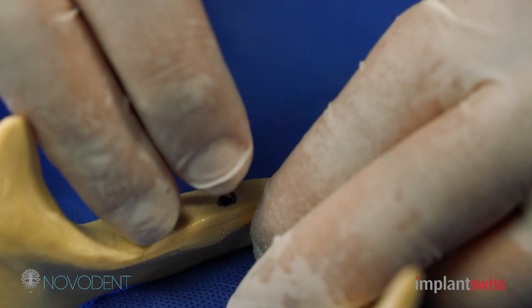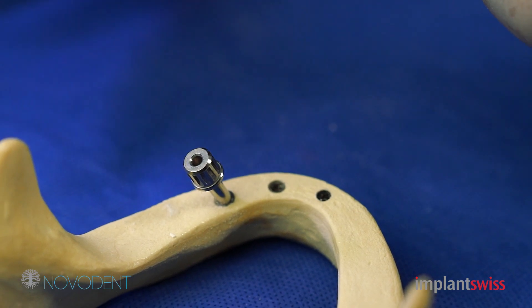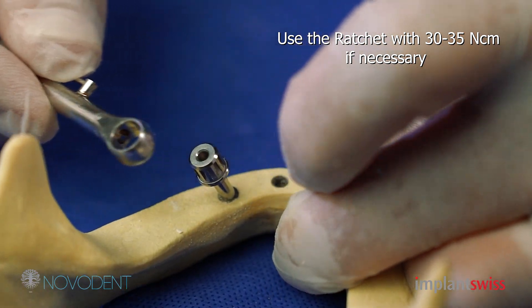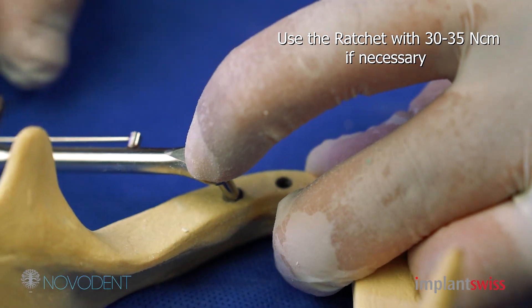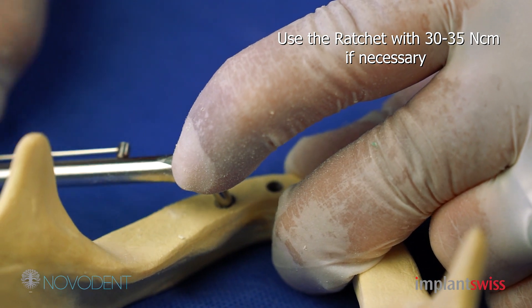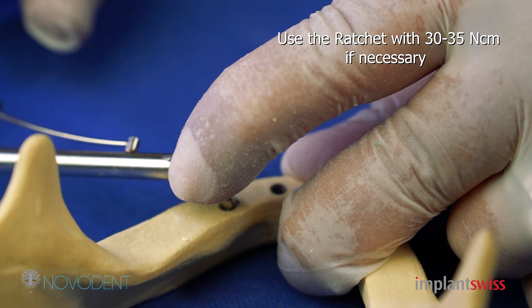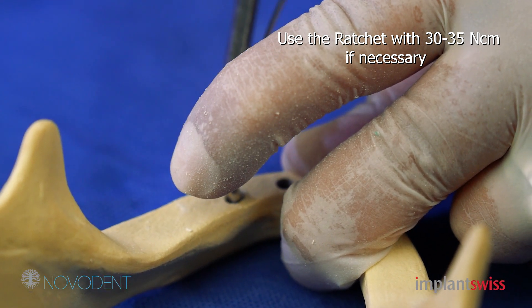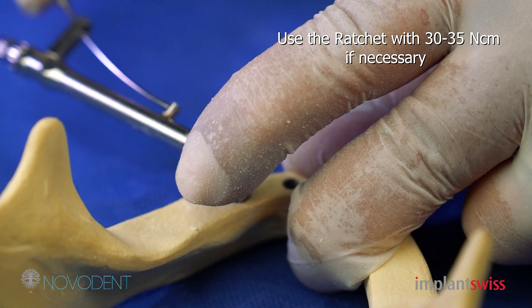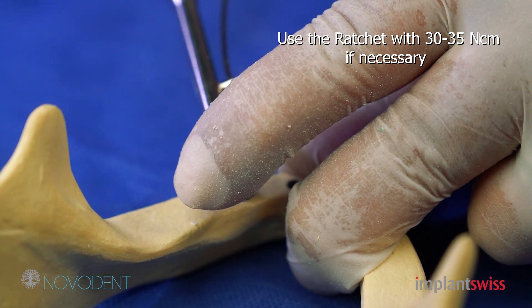If you have a very hard bone and you need to place the implants further using the ratchet, you can do it this way. This is the finger key and this is the ratchet. You start placing the implant further according to the depth you want to submerge your implant. This is a gradual ratchet where you know how many newton centimeters you place the fixture.